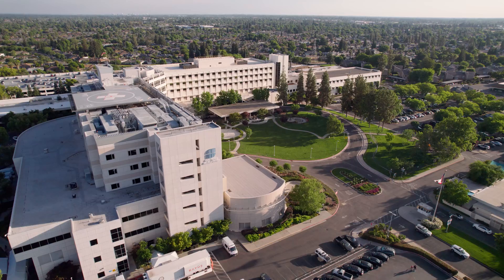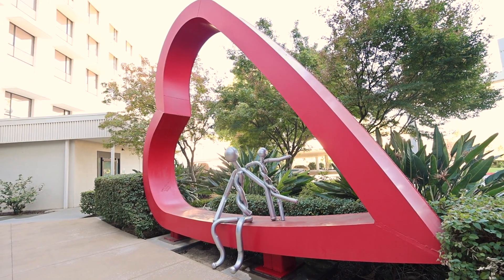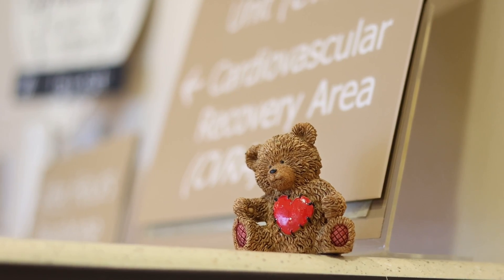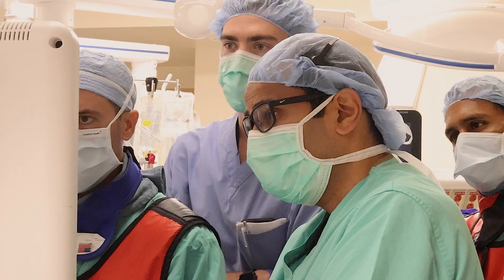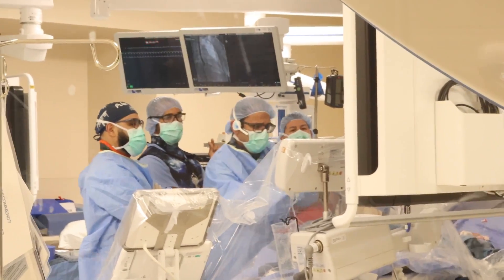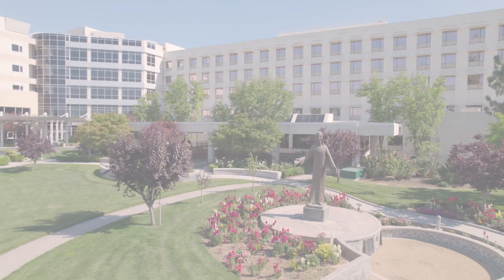We at St. Agnes have always been at the forefront of cardiology and medicine at large for decades. We felt that a lot of our patients had no option but to travel up north or down south. This is a way that patients who cannot go through open heart surgery would have a good option to reduce the leakiness of the valve and help improve their symptoms.